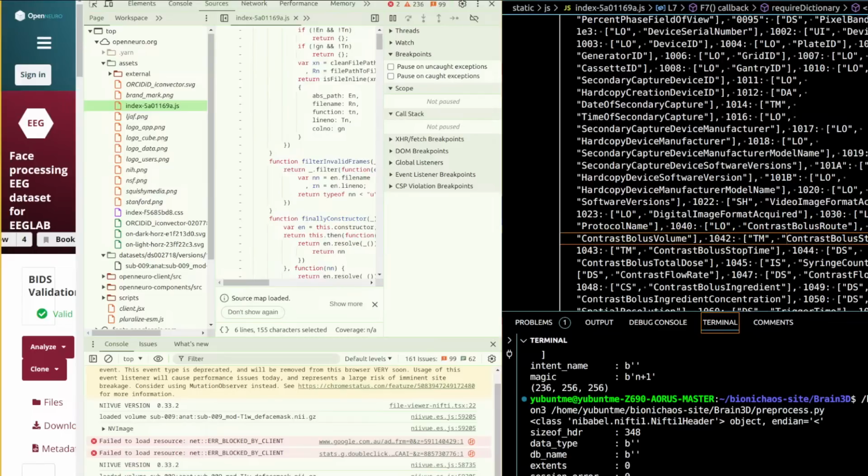Expected benefits. Faster loading times. Reduced file size and efficient data handling lead to quicker load times. Smooth interaction. GPU-accelerated rendering ensures smooth panning, zooming, and navigating through the MRI data. Scalability. Incremental data loading makes the application more scalable and responsive even with large datasets. By implementing these changes and optimizations, your MRI viewer can achieve the performance and interactivity levels seen on platforms like openneuro.org.